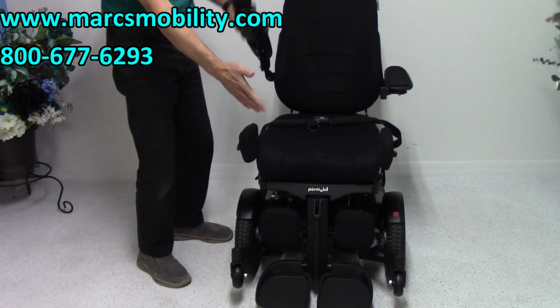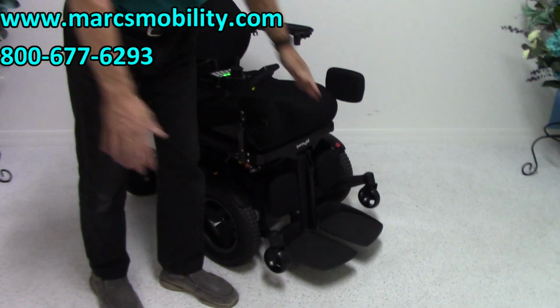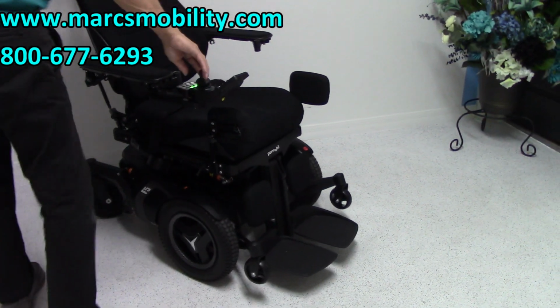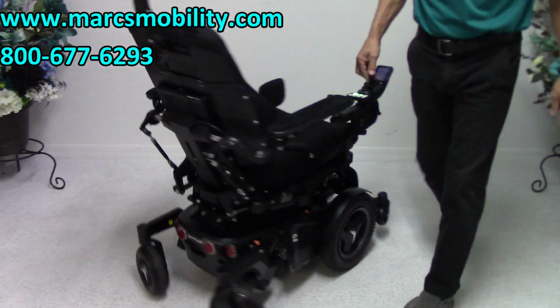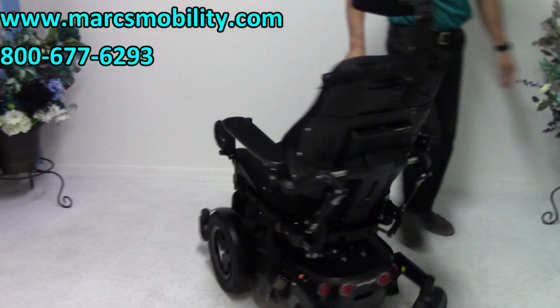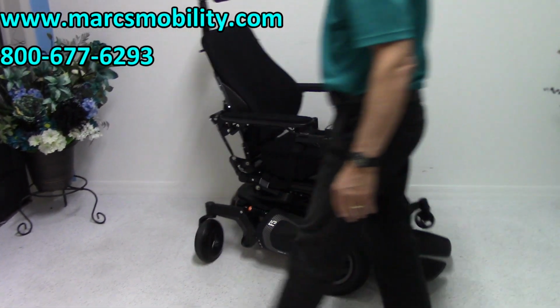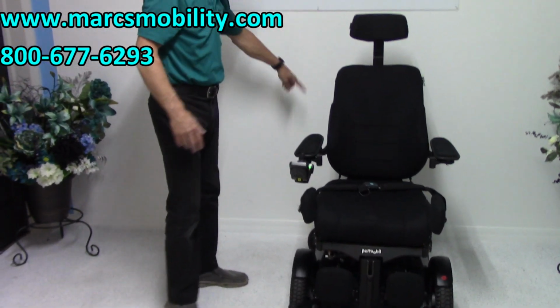So when you're in the house, you want to keep your foot plate more in so you have a better turning radius. But if you're turning in the house, this is what it's going to look like. This is your turning radius in the house. So you need to give it about 4 feet. You don't want to scrape your wall like I've done a couple times here.